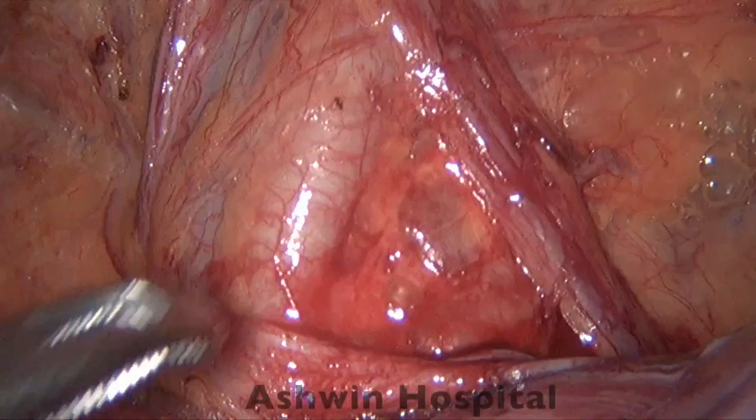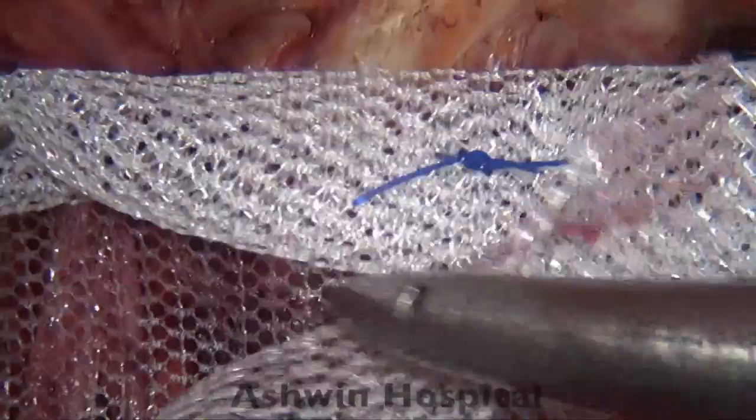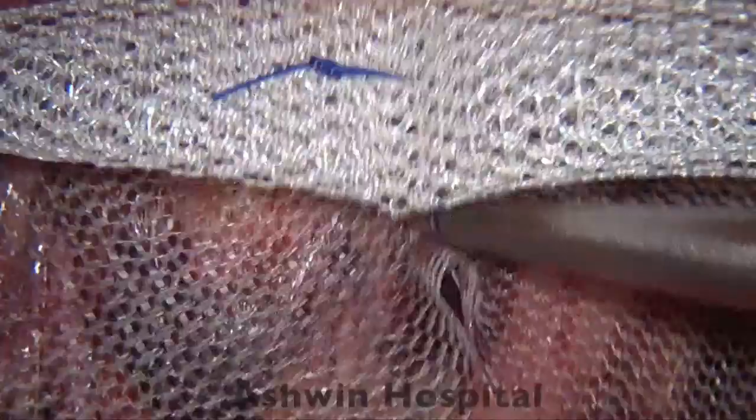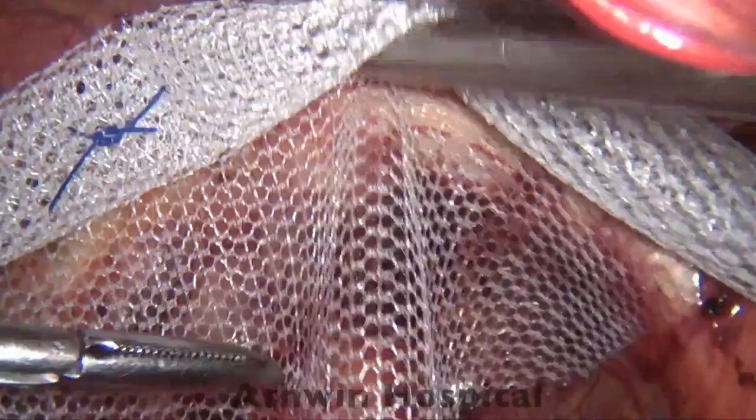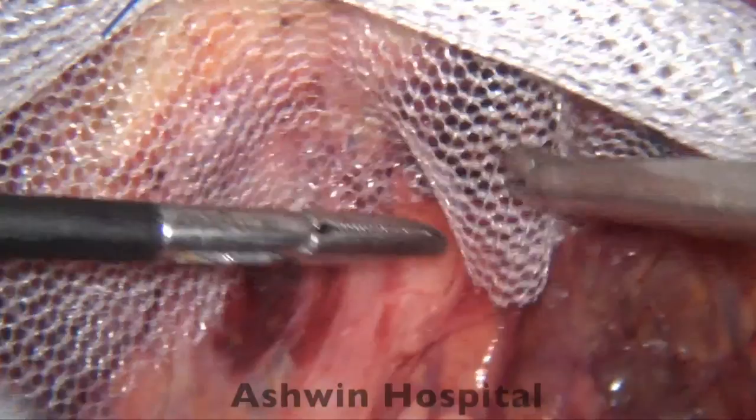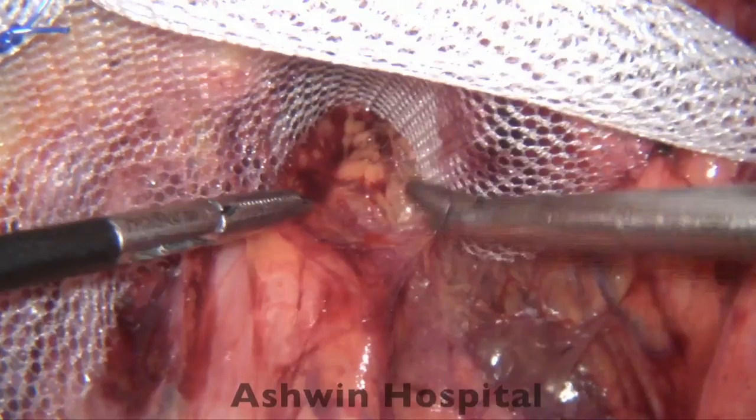So you can see the parietalization done extensively. You can see how much the peritoneum has been mobilized. So that way the mesh can be placed there and the peritoneum can be pulled over the lower border of the mesh to keep it sandwiched to the sidewall. You can see once the dissection has been done adequately, a 15 by 12 centimeter mesh can be easily placed. You can see the mesh is not crumpling a lot and you have a good working space available for you to place the mesh, and this is what is called a good landing zone. And if we have this adequately in all the patients, then the chance of recurrence is almost negligible.